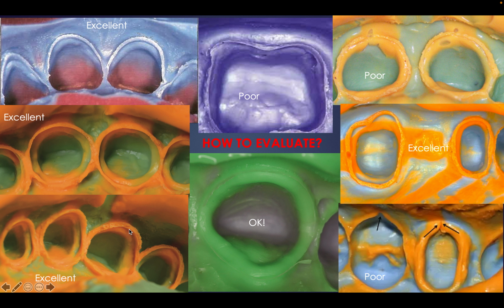What comes after that here, if you capture it, is the impression of your sulcus, which captured a little bit of the tooth and your impression of the sulcus. So you can read the impression easily. What does reading the impression mean? You have a clearer view of exactly where your demarcation is, exactly where your margin is. Everything is clear. Look at this one. Can you tell where the gingiva is in this area? This is the remaining gingiva. This is your sulcus, like a line demarcating, and this is your margin.